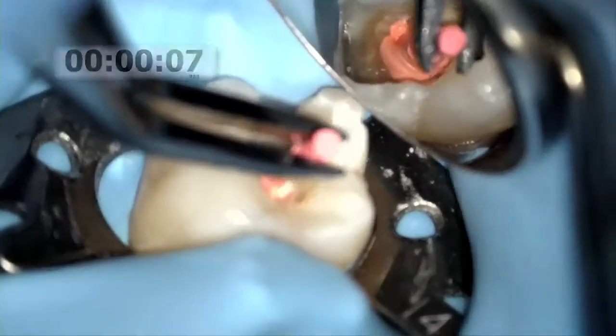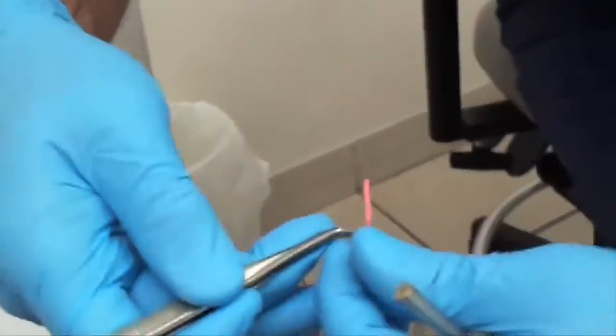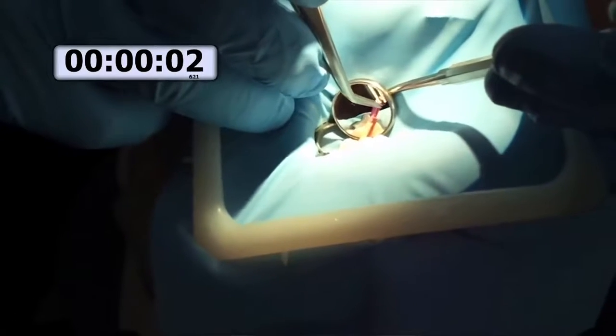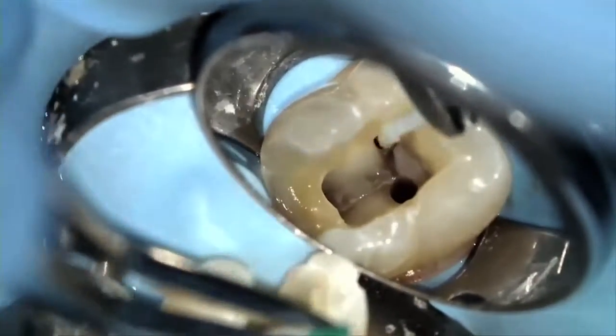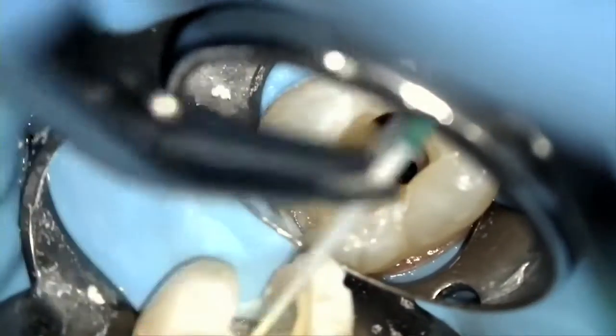During this step, remember not to touch the pulp chamber walls. I recommend that you count as you insert the GuttaCore into the canal — you, and even your assistant, should count while inserting. Engaging your assistant in this simple but most crucial step can only help. As Dr. Sergio Cutler recommends, count during insertion as follows: one elephant, two elephants, three elephants, four elephants, five elephants, six elephants, seven elephants — and now you're done. The canal is obturated. Remember that this step is similar to what we do when drying canals with paper points, except here it should be done in about seven seconds. In fact, while drying the canals prior to obturation, practice doing so in seven seconds. If you insert the GuttaCore too slowly or too quickly, you will not obtain a good obturation.